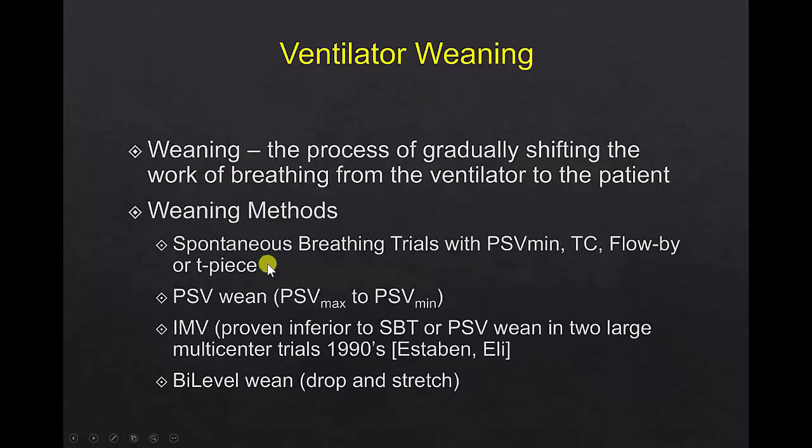Weaning methods include spontaneous breathing trials with pressure support going down to minimum pressure support. Let me just say that again. Spontaneous breathing trials with pressure support set at minimum, tube compensation trials, or flow-by trials. Another mode of weaning is pressure support ventilation weaning, starting at a higher pressure support where the patient's mostly supported and slowly weaning down to minimum.